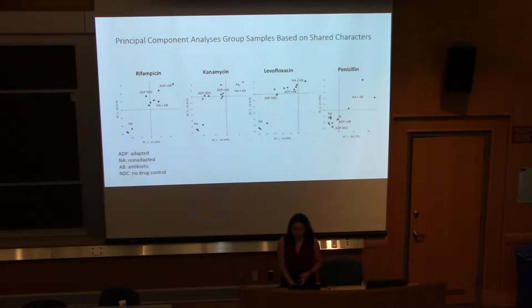We then wanted to see if we could actually detect the presence of resistant bacteria in a population from this sort of analysis, and whether we could accurately predict the percentage of resistant strains. So we carried out BCP on mixtures of adapted and non-adapted bacteria at known ratios.